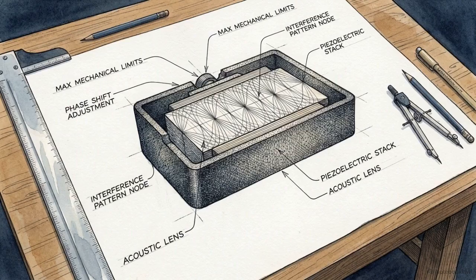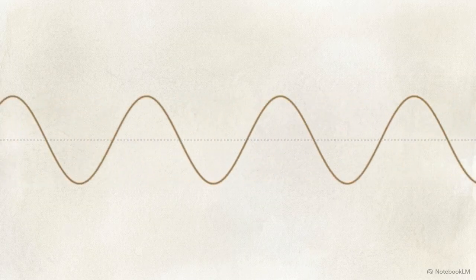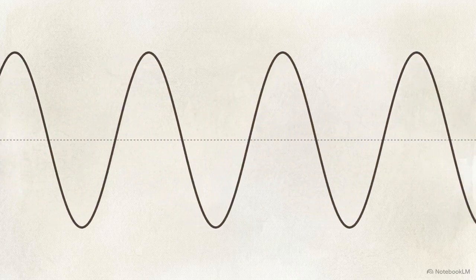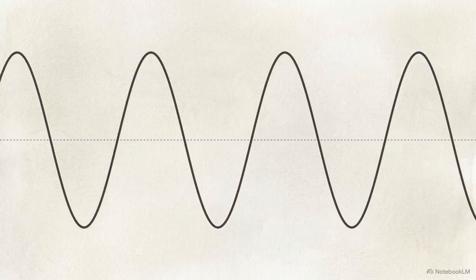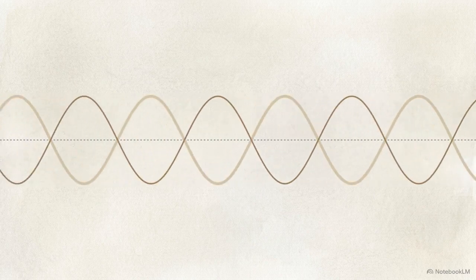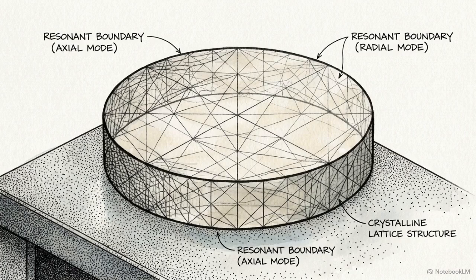Efficiently maximizing acoustic output requires the transducer design to leverage the physics of wave interference. This is constructive interference. When two sound waves cross in the exact same phase, they combine and reinforce one another, compounding their amplitude. If those waves cross in different phases, however, they cancel each other out and ruin the signal. Transducer design relies on natural or resonant frequency to ensure these waves stack constructively.